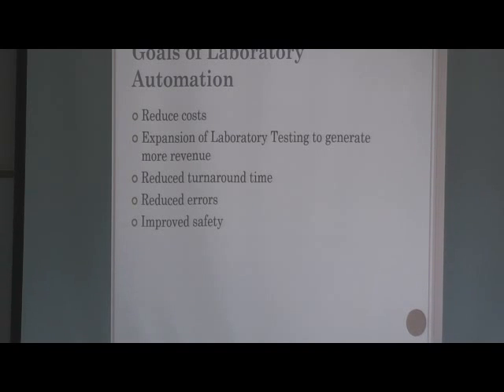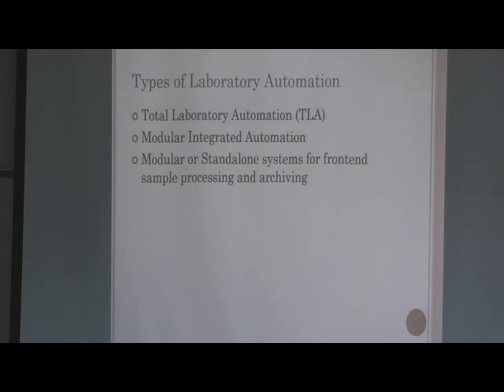Less chance of cross-contamination, blood on you. Yeah, exactly. If the machine's doing it all, there's less chance that you're going to poke yourself with a needle or contaminate yourself and so forth. Also the nasty chemicals that some of these chemistry tests use are all back there in the machine, although you'll probably be loading the reagents and whatnot. So there's different types of systems.